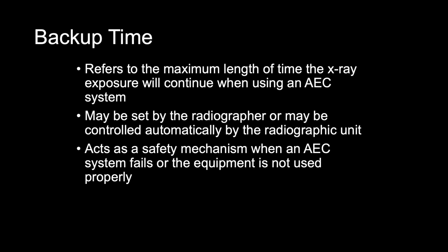If the backup time is controlled automatically, it should terminate at a maximum of 600 mAs when equipment is operated at or above 50 kVp. So the function of the backup time, the maximum exposure time allowed during an AEC exam, is to serve as a safety mechanism when the AEC is not used properly or is malfunctioning.